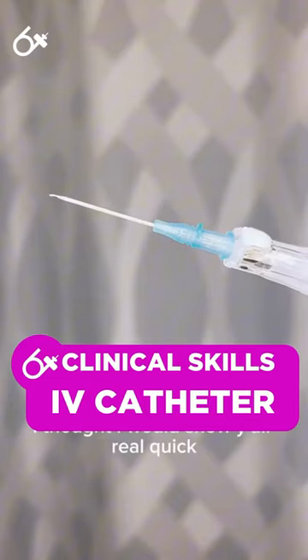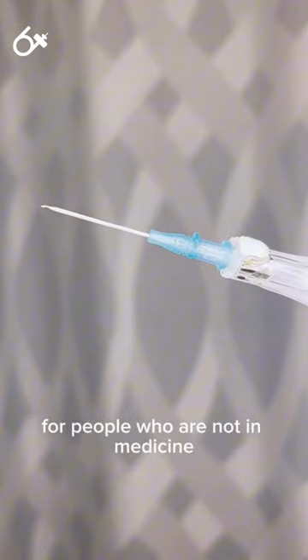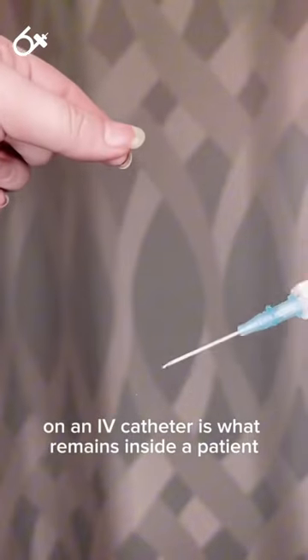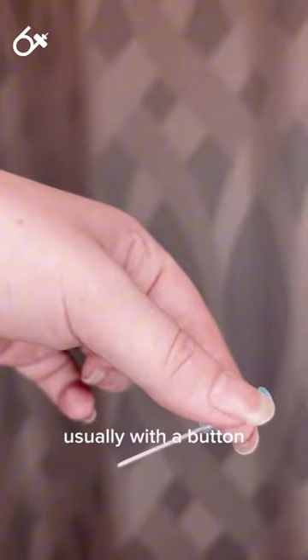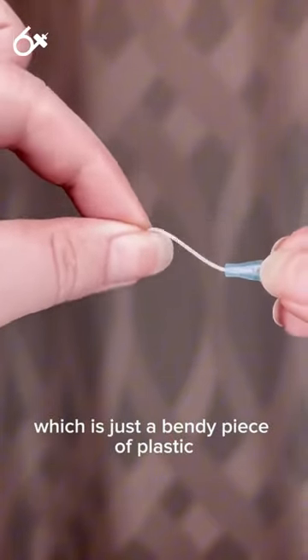I thought I would show y'all real quick how an IV catheter actually functions. It's a common misconception for people who are not in medicine, or people who are new to medicine, that the needle on an IV catheter is what remains inside a patient. But once we insert it into the vein, the needle is withdrawn — usually with a button — and what remains is the catheter, which is just a bendy piece of plastic.